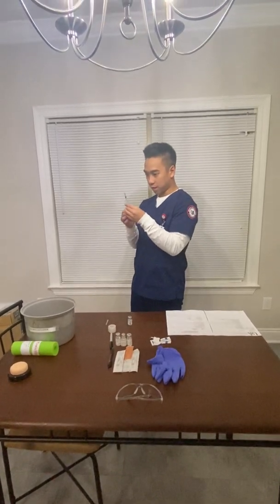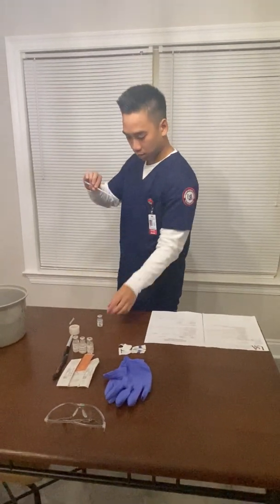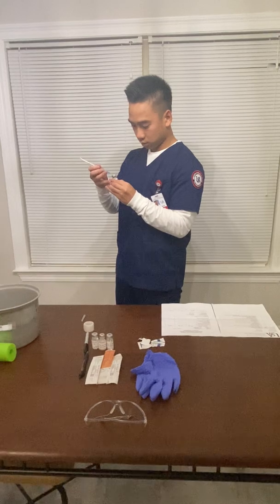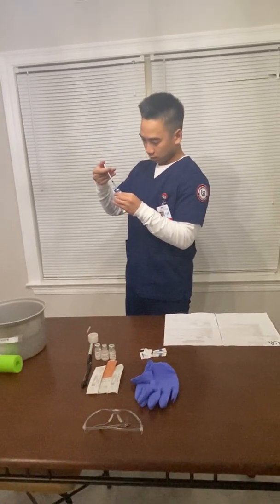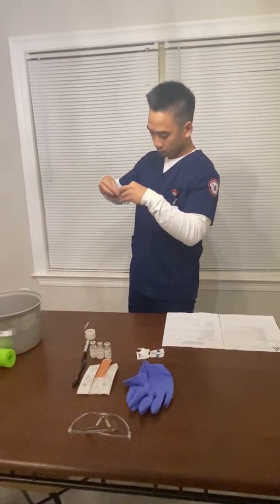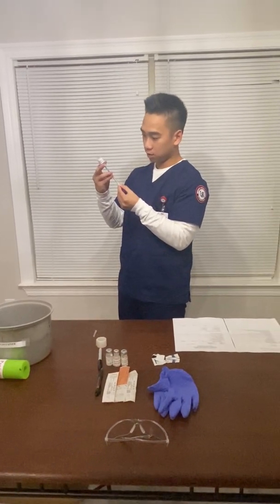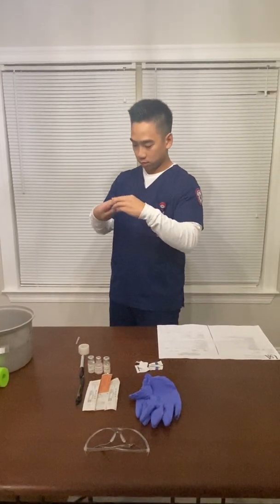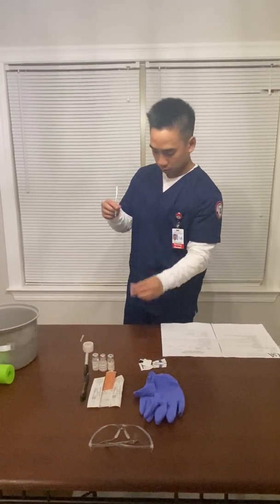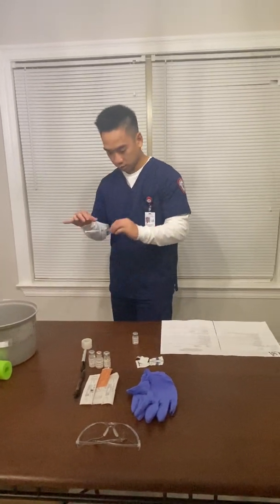I'm going to draw out half a milliliter of air. Inject. I'm going to expel that half a milliliter of air. Then I'm going to draw out half a milliliter of heparin. So for heparin, you do not want to expel the air bubbles, so I will not be doing that. I'll use the scooping method to recap my syringe.